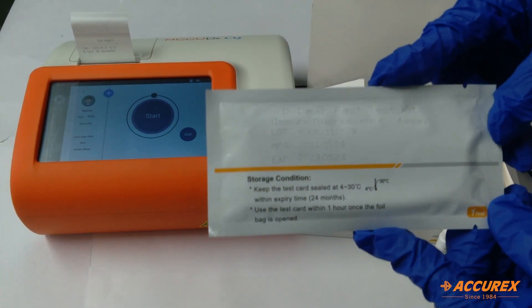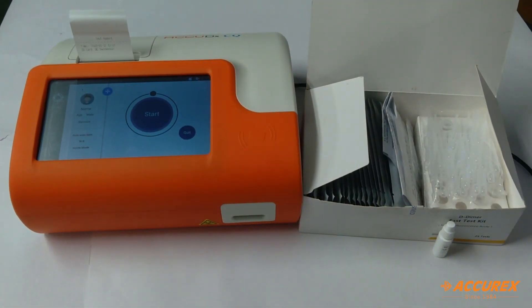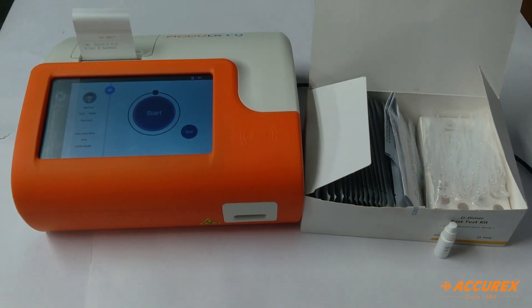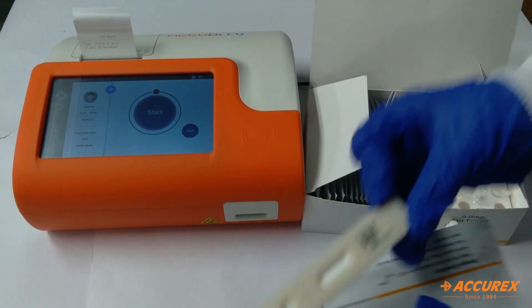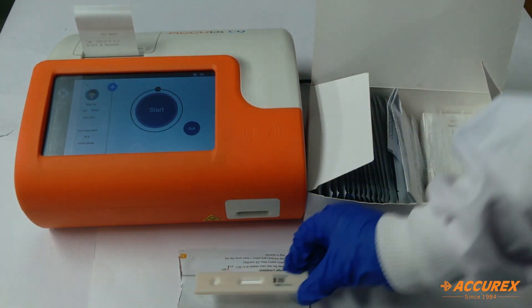This is the test kit — that is the strip — so we'll open this. The strip looks like this. We'll keep it in a clean horizontal place, so we'll keep it over here.